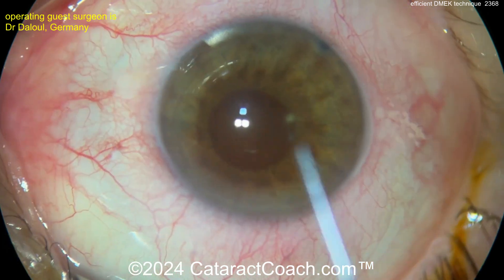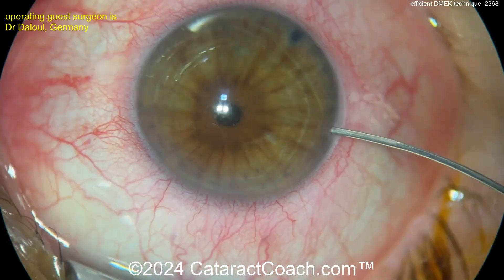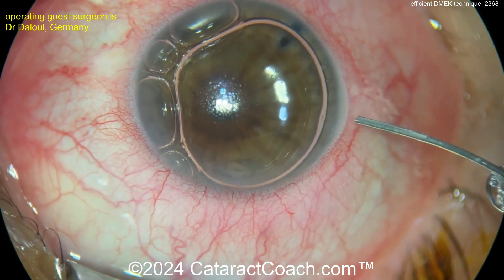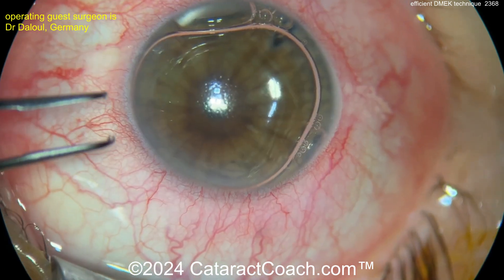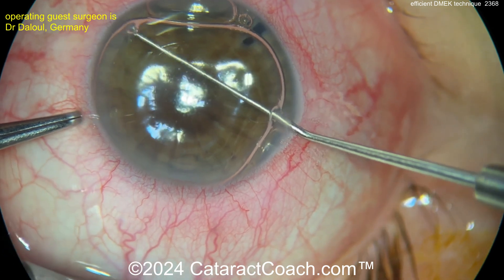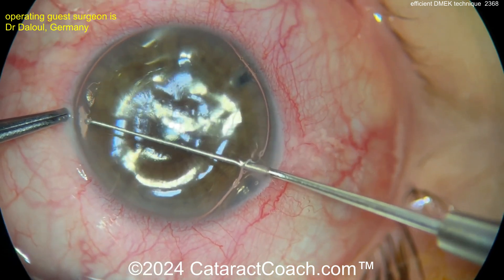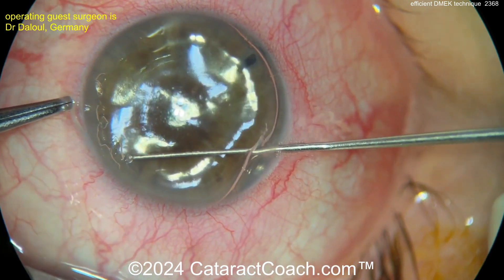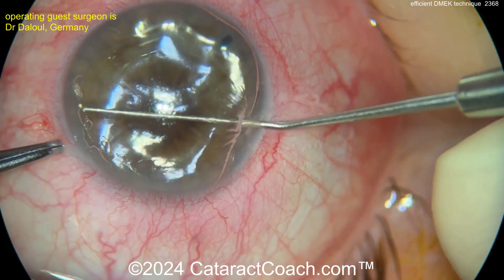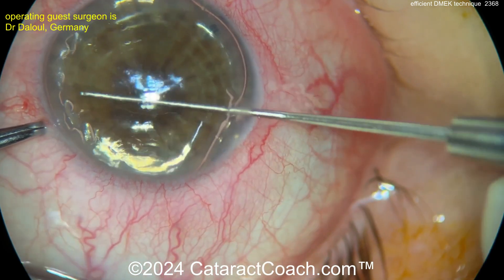Now here's the eye. What we have to do is strip off the existing Descemet layer. So we bring in a pupil constriction. There's a little bit of an air bubble. Notice there's already an inferior peripheral iridotomy that's been made. Now going in with a reverse Sinsky hook, tracing around, scraping and scoring that endothelial layer — that Descemet membrane — and then we're going to peel the whole thing off.